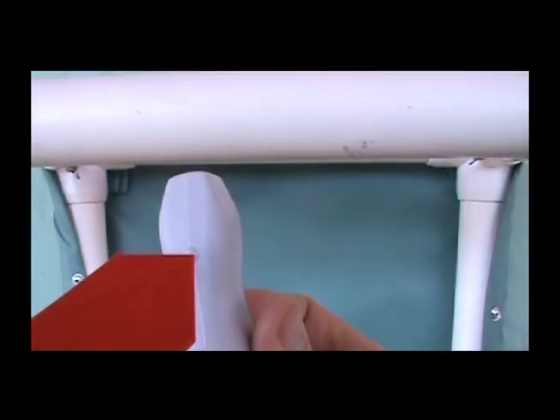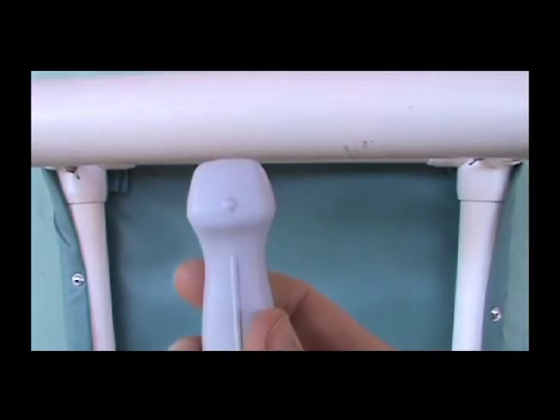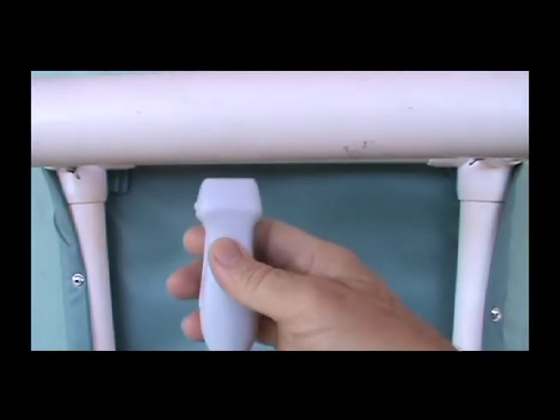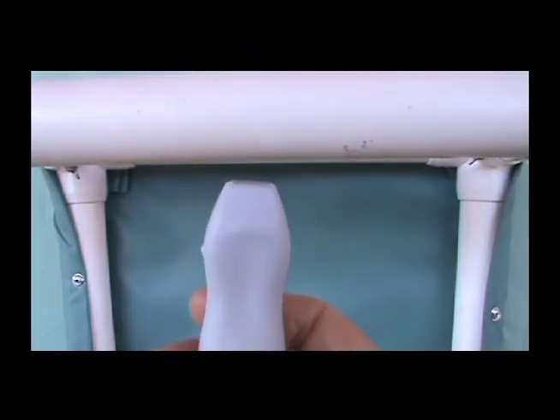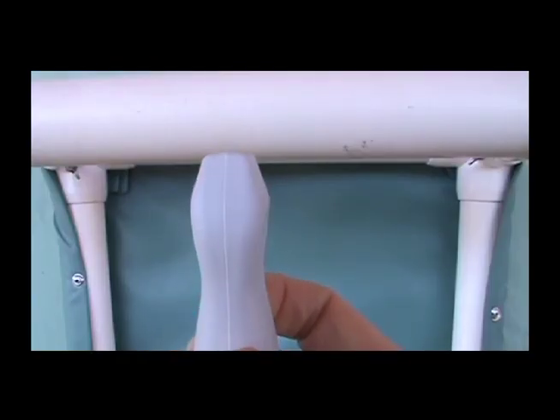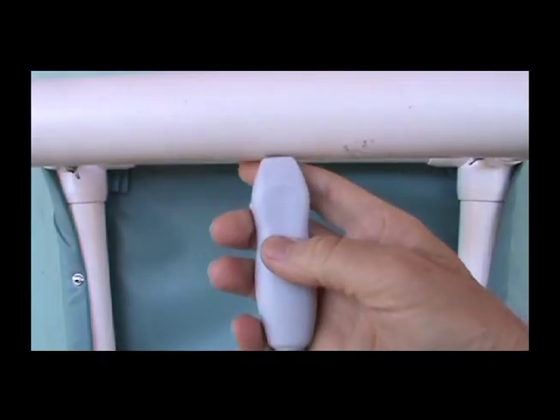For dogs greater than 40 pounds in body weight, I recommend the lower frequency transducer. Many lower frequency cardiac transducers have a variable frequency from 1 to 5 MHz. The higher frequency will give a better cardiac image, and the lower frequencies are better for color flow and spectral Doppler images.